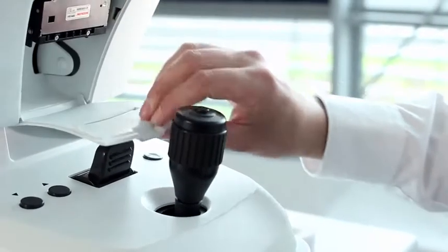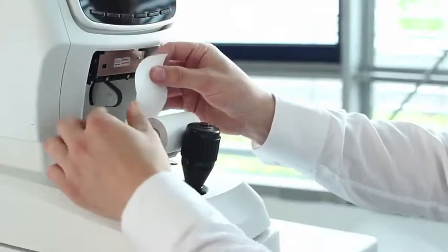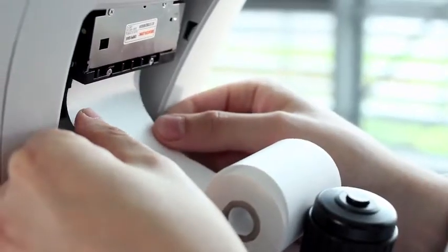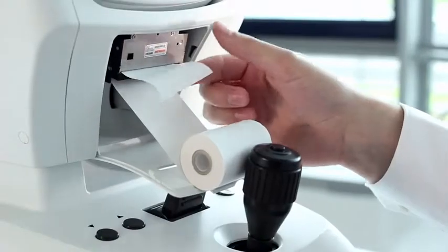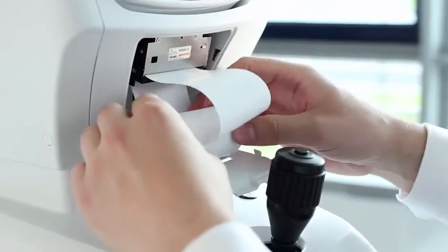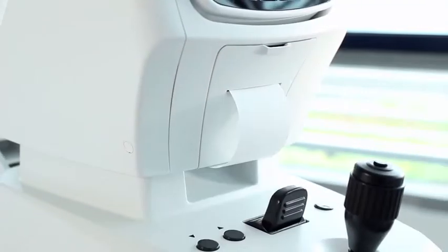The Zeiss Viseref 100 features an integrated thermoprinter with auto-cut function. Reloading paper is simple. Just insert the new roll with the paper coming off the top and place the leading edge of the paper into the slot just behind the front of the print head. The printer will automatically feed the paper into the correct position. Then close the printer door. Done.